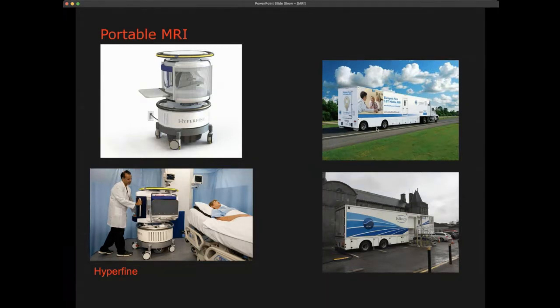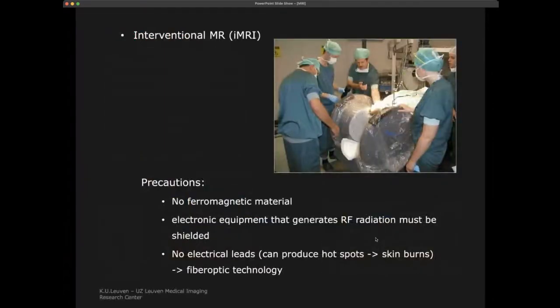Because this is also metal caging, it's very much caged. This way you can either go as displacement, or in some hospitals, because it can be expensive to build this room, they put the truck with the MRI scanner outside and they just make a tunnel to the hospital in order to do it. So this is one way to solve some of these problems.